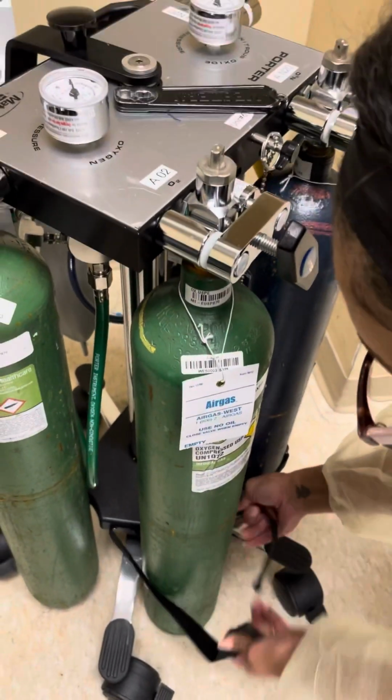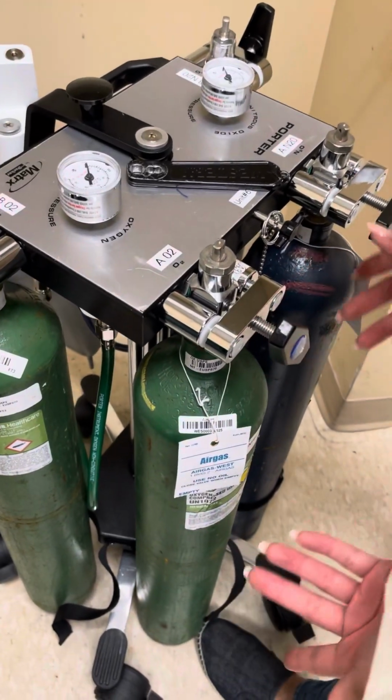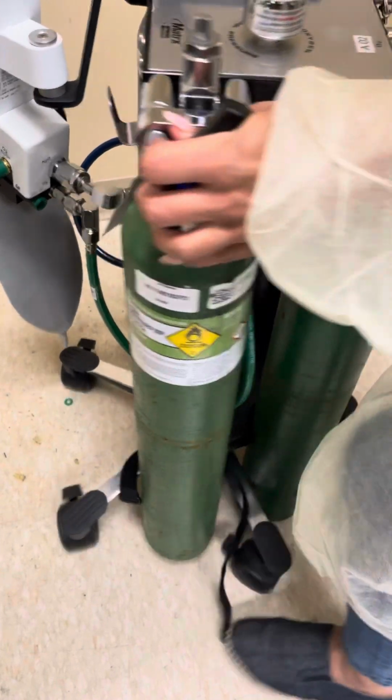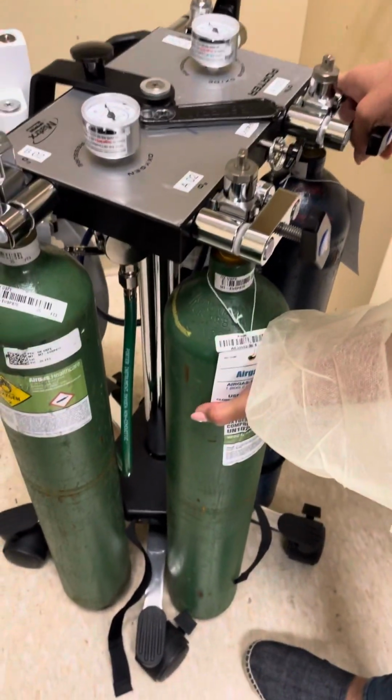You'll then open these here. You'll put your foot under if you can. Some of these are low, like some of these are higher than the others. So see, this one I can get my foot under. This one I can't really get my foot under. So if you can't, that's okay. Just secure it with your hand.